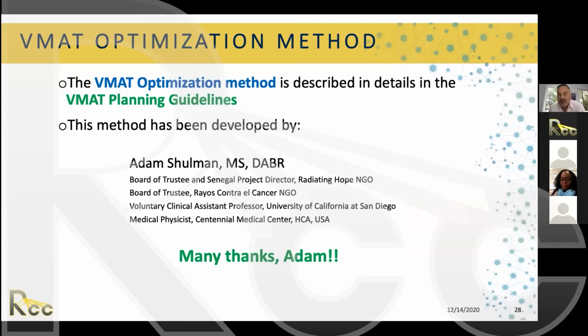Like I said, you might already be doing IMRT or VMAT plans in your institution, so you can use your own techniques. At Memorial, for example, we use kind of the same thing, but with some deviations. But we wanted to have one method that we can all follow, because you're going to have some planning challenge cases, so we would like you to follow this method to do the planning.